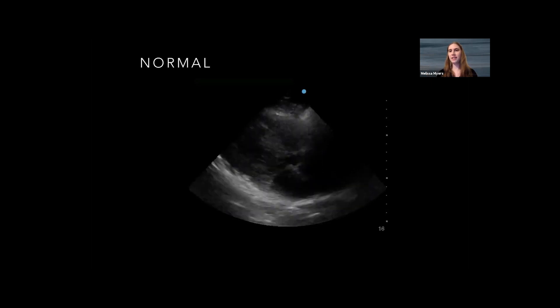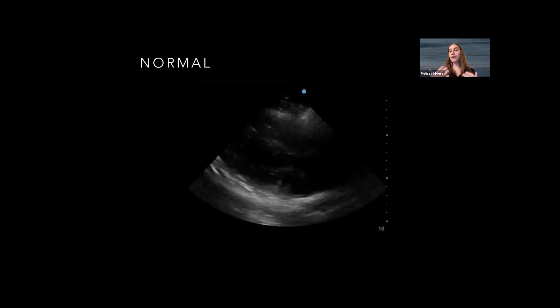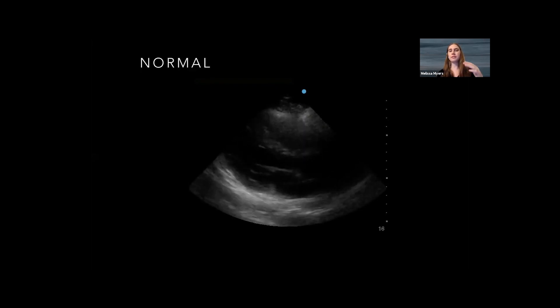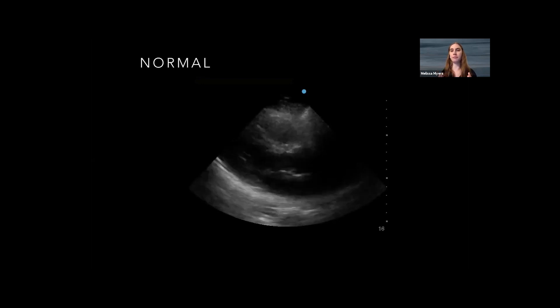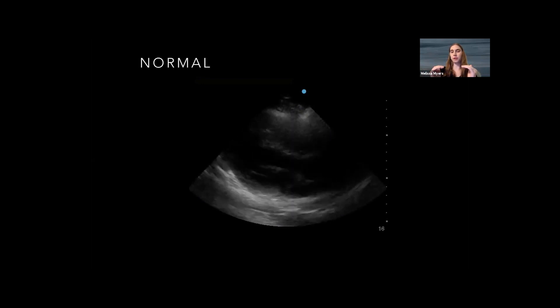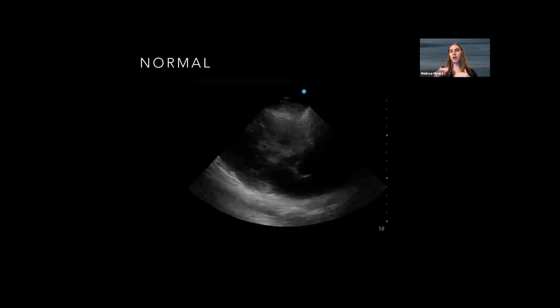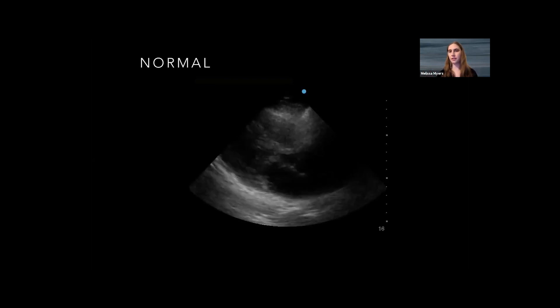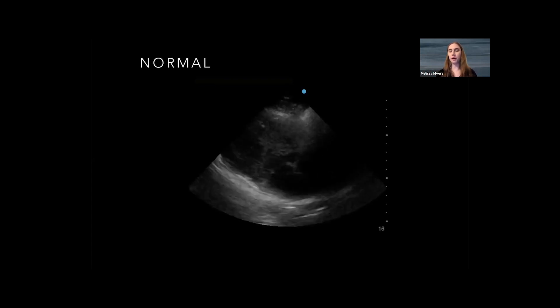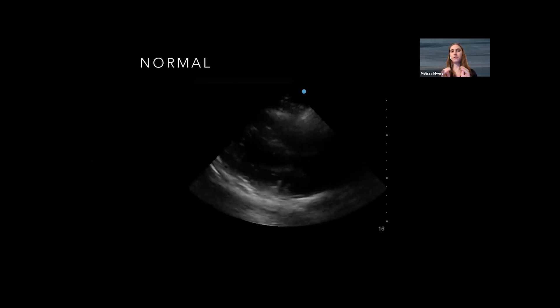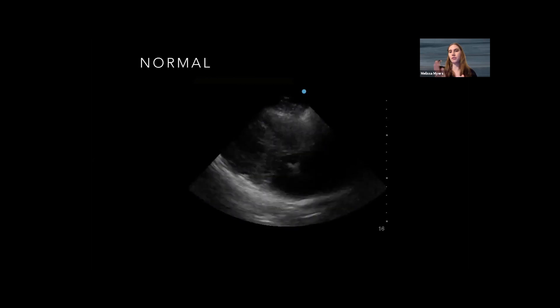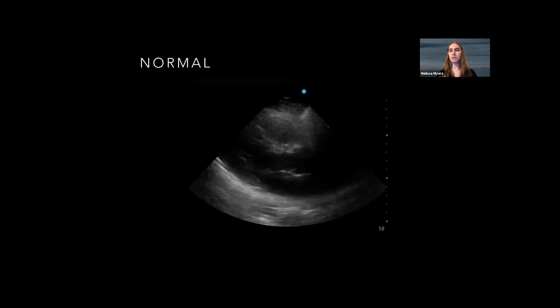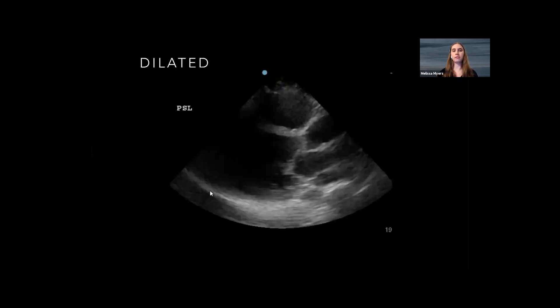This is my current ultrasound fellow's heart — it is a normal heart. He does not have right heart dysfunction. The way I know that, at least based on this view, is I'm looking at roughly the size of the right ventricular outflow tract, which is the chamber at the top of the screen, the aortic outflow tract directly below it, and the left atrium. All three of those chambers should be roughly the same size. If one is significantly larger than the others, there's probably a problem in that chamber — and I'm concerned that the right ventricle is dilated.